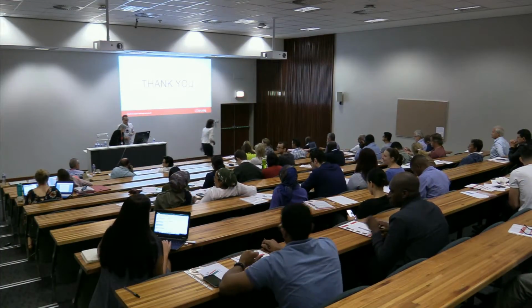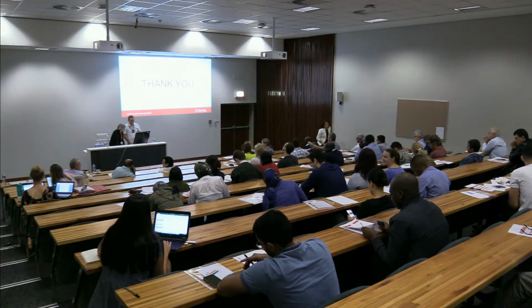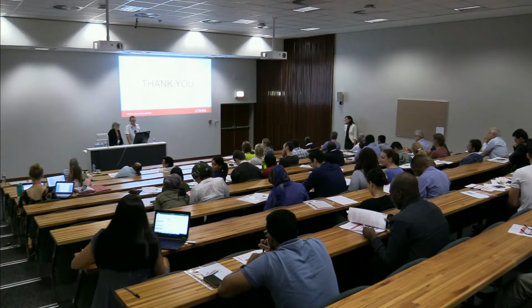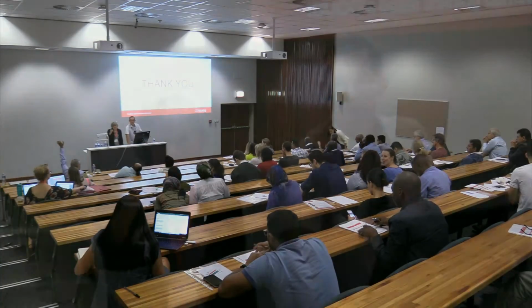I think I've opened up all this water. It will be very, very quiet on the other side. I need to take this out, but I can do it later. Yes, okay. Do you have any question?